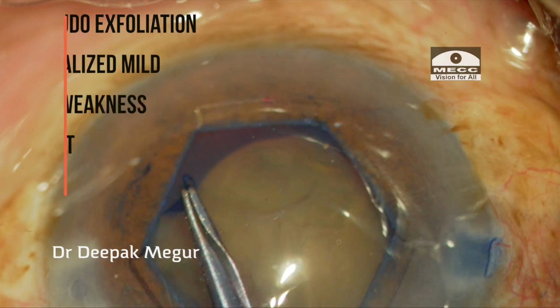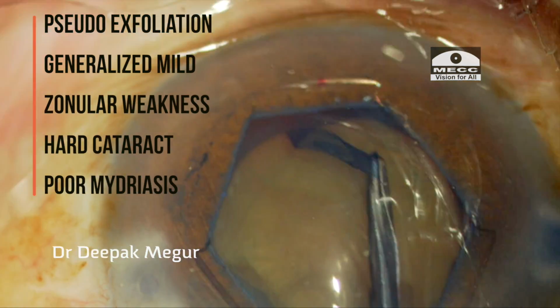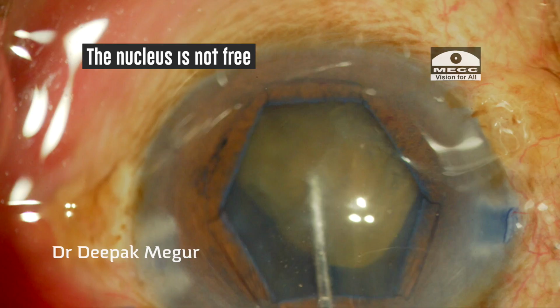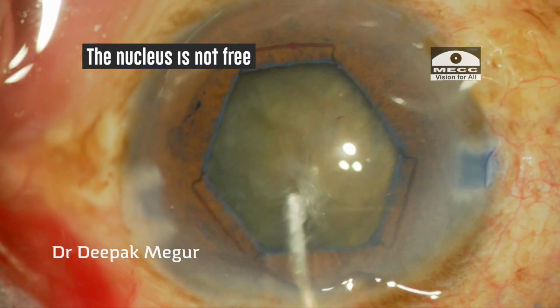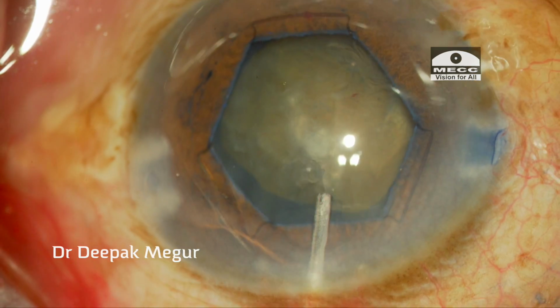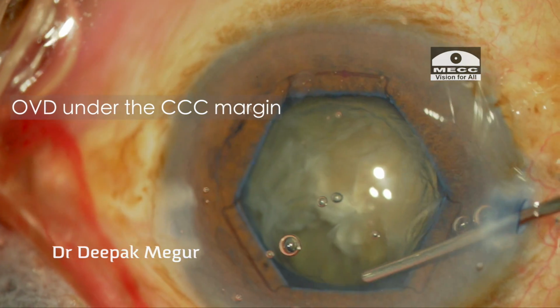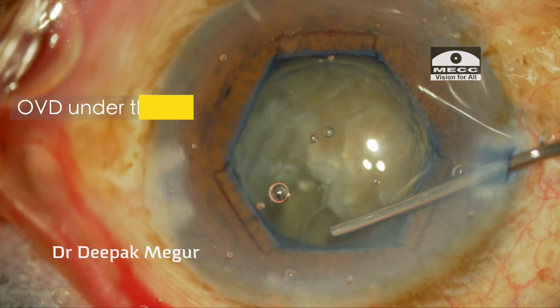Moving on to the next case. After rhexis, I am performing hydrodissection, and at this stage I realize that the nucleus is not free from its attachment to the bag, and the bag moves when the nucleus is being moved. At this stage I decide to insert the ring. I am injecting OVD under the capsule. This will create some space.